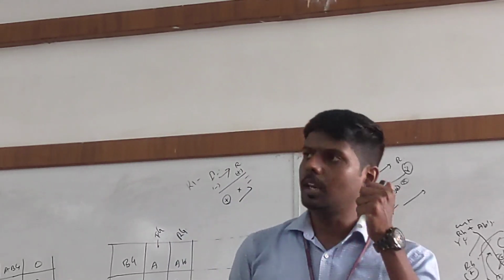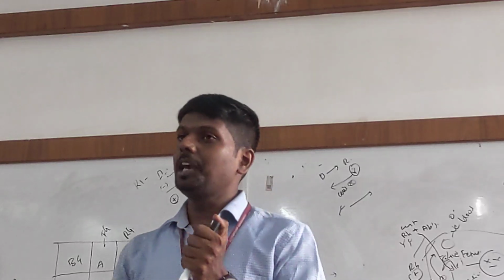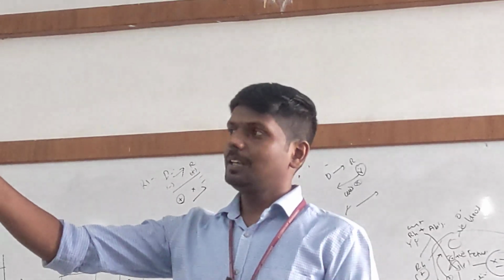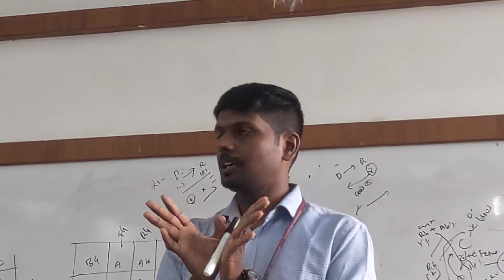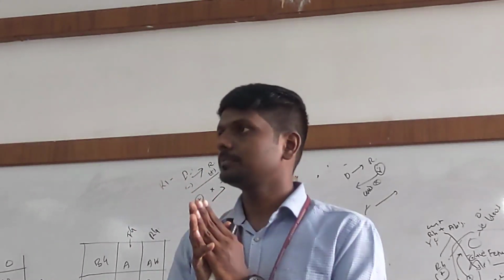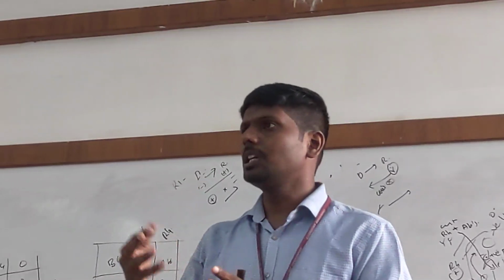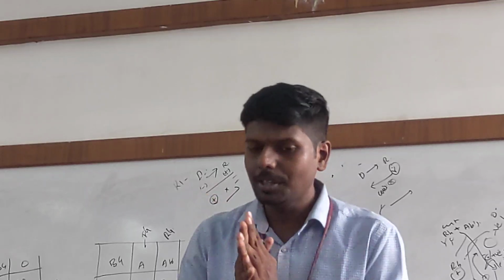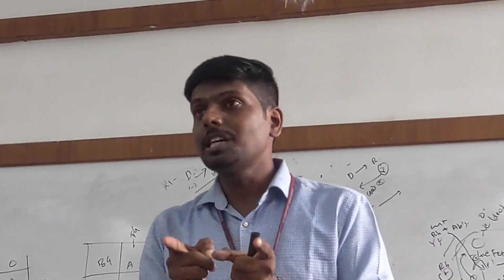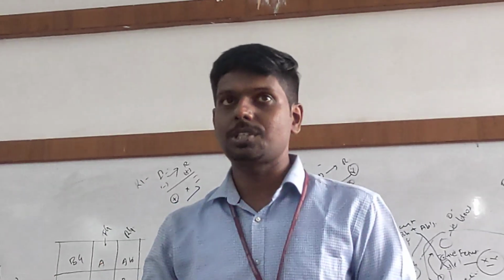Suddenly he got a call. He was sleeping, and suddenly he got a call that they needed an urgent O negative or O positive blood for the emergency ward. Universal donor, the O group, and our technician had an issue. He must receive the patient's blood. He must do a cross matching.